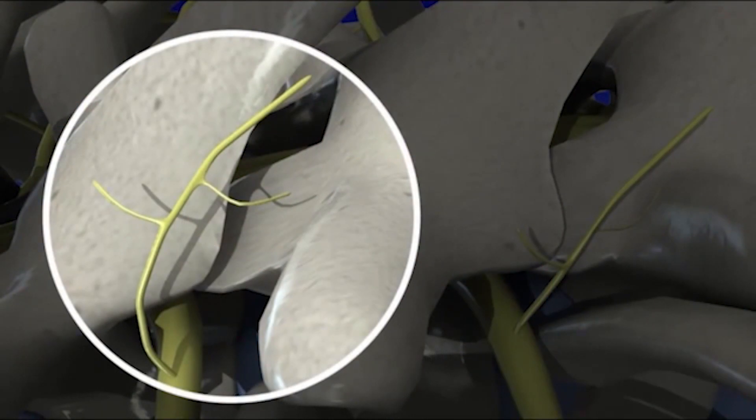A radiofrequency ablation is a minimally invasive outpatient procedure in which we use image guidance — whether that's x-ray or ultrasound — to place one or more needles next to a nerve, and then use a small probe through that needle to heat that nerve and stop it from sending pain signals. This is usually a quick procedure within 30 minutes, and it can be applied to multiple areas of the body.